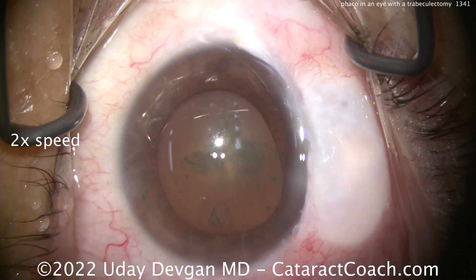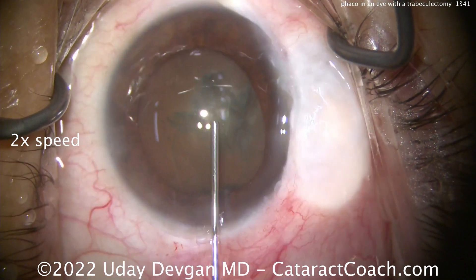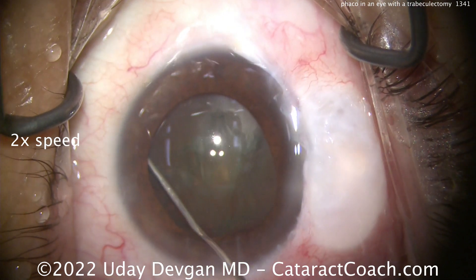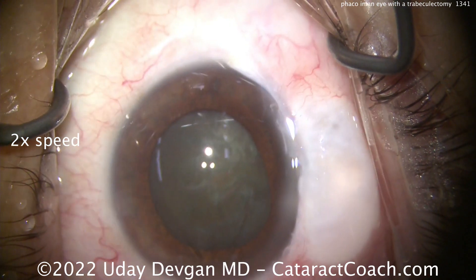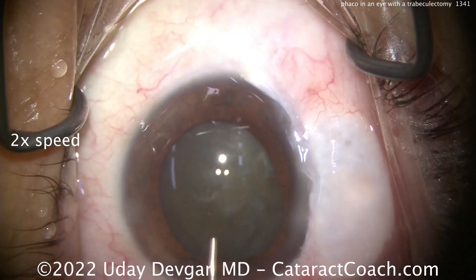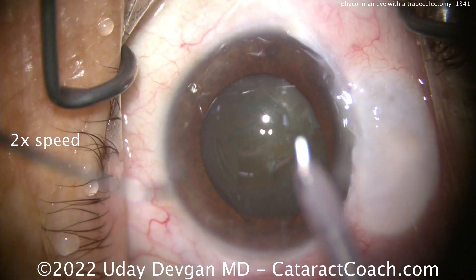That's a smaller rhexis, so you can measure it out — looks like it's just about four and a half millimeters. That's going to give a little bit stronger overlap. Now, we're going to make a lot of FACO chops in that capsular bag, and we're not going to prolapse this nucleus out of the bag with a 4.5 mm rhexis — that's a little too tough.